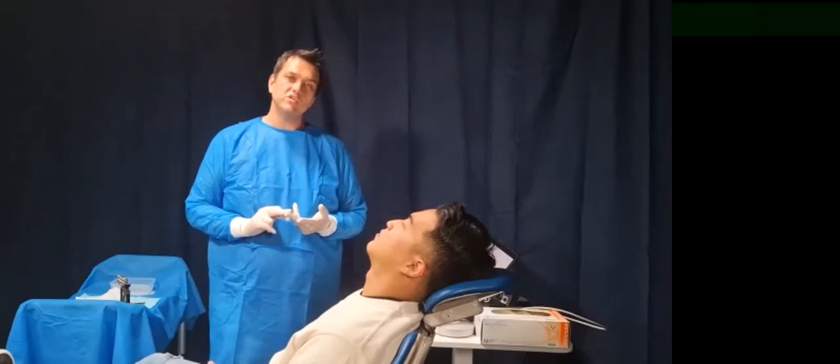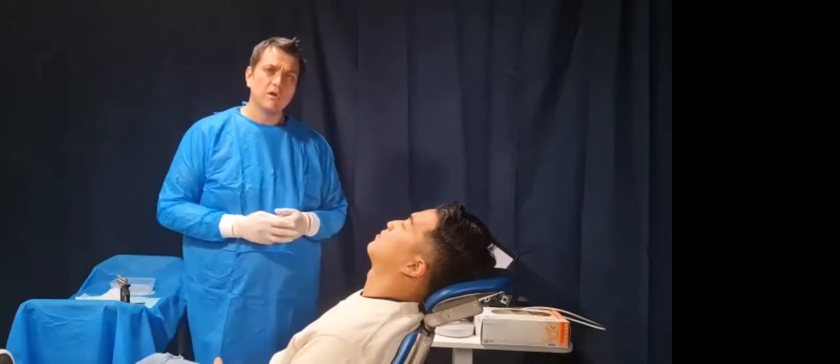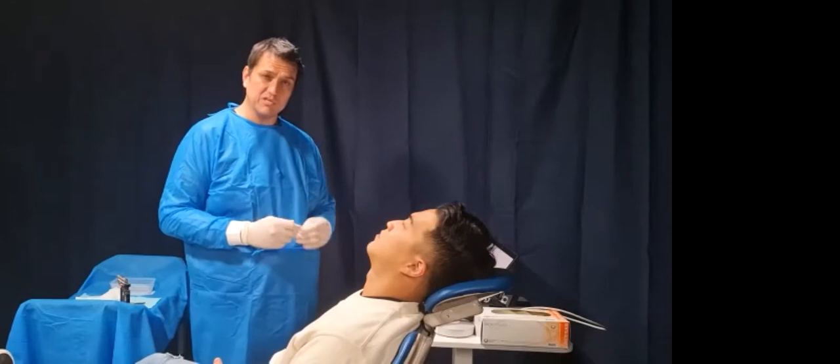The second thing we're going to do is look at the two very difficult cases. One, which is a lower canine opposing a full upper, and the other one is we've got two standing molars on the lower opposing, again, fully dentate, or it's actually partially dentate with a denture on the upper. Impossible occlusion cases, and they both will present challenges, and I'm sure you're going to learn from both of those today as well. But anyway, let's get straight into this section, which is how to open a bite.